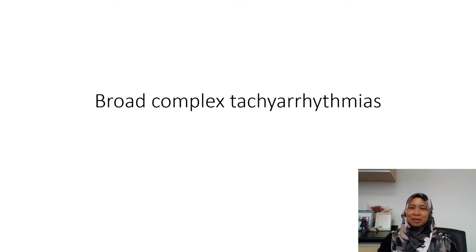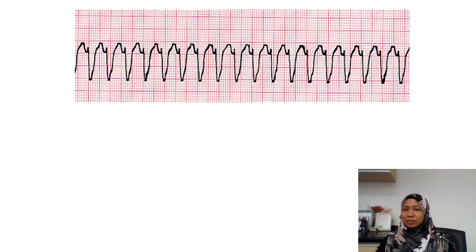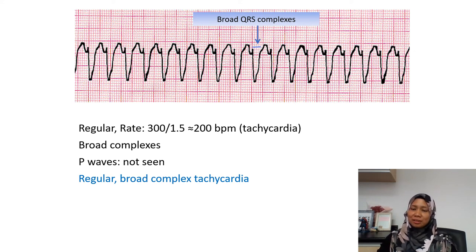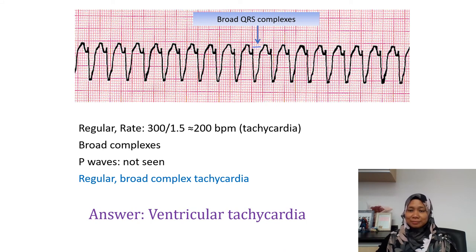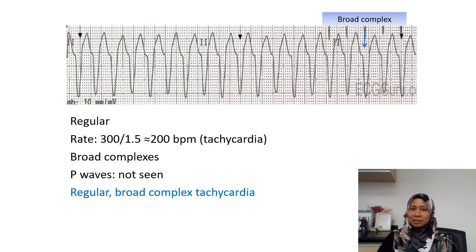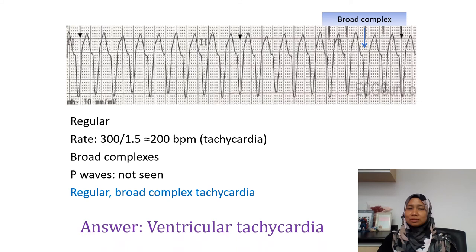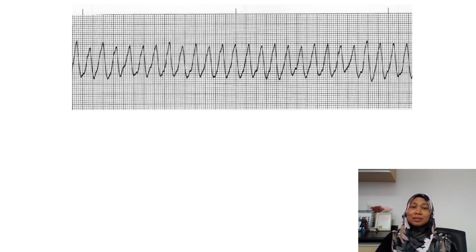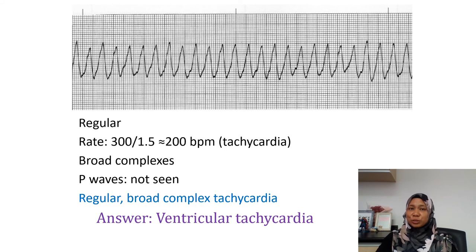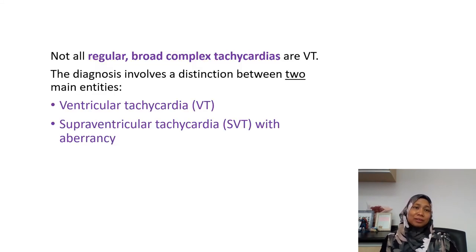Now let's go to broad complex tachycardia. The first strip shows a regular rhythm, rate about 200 beats per minute, broad complexes, and P waves are not seen — this is a regular broad complex tachycardia, and the answer is ventricular tachycardia. The next two strips are also regular broad complex tachycardias — both are ventricular tachycardia. However, not all regular broad complex tachycardias are ventricular tachycardia; we also have supraventricular tachycardia with aberrancy.